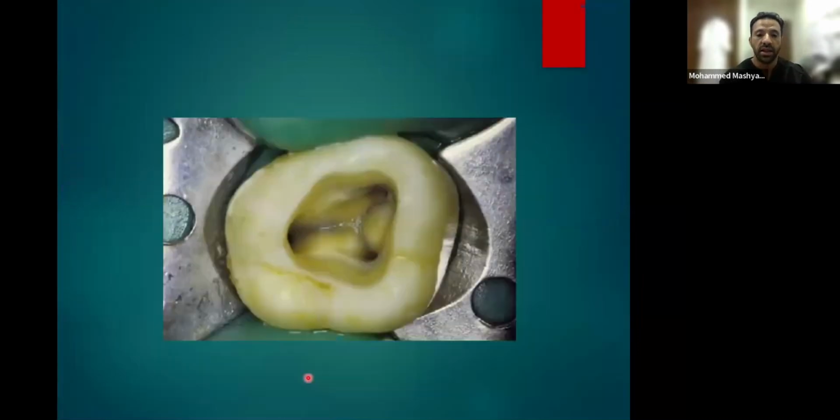Here is another design or another tooth. You see the floor of the pulp chamber, you see the map, you see the darker side of the pulp chamber. It leads you immediately to the canal. You cannot see these things unless you have good magnification and you have ultrasonic tips. So the access cavity through the molar will be much, much easier, okay?